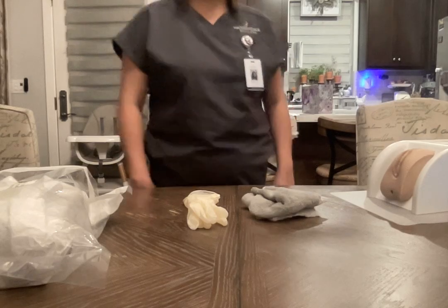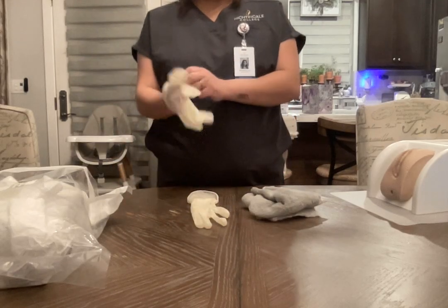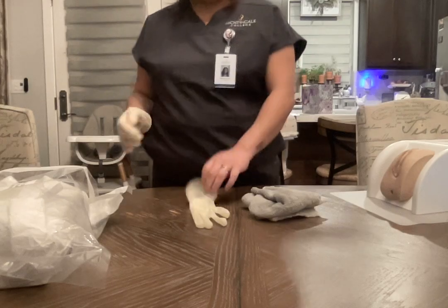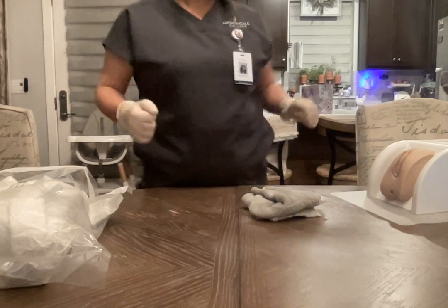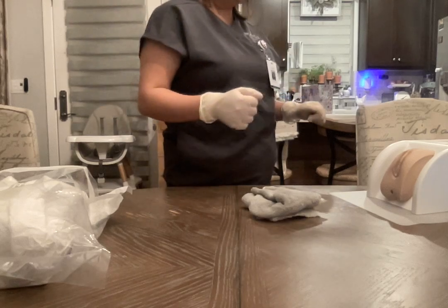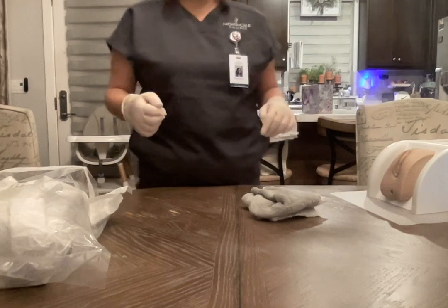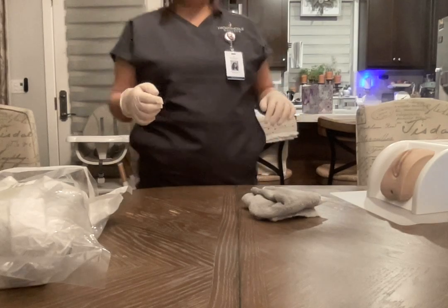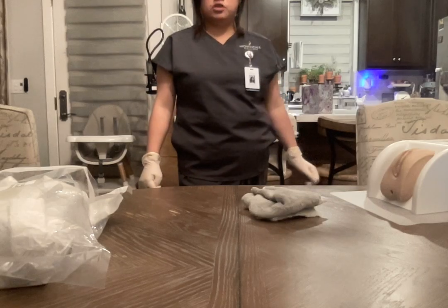Alright, so I'm gonna put on some clean gloves and clean the patient's perineal area with no rinse soap and by using a towel. Can you please bend your knees and lay them open and your feet apart? Thank you. So we're going to wash anterior to posterior and afterwards dry them using a dry towel.